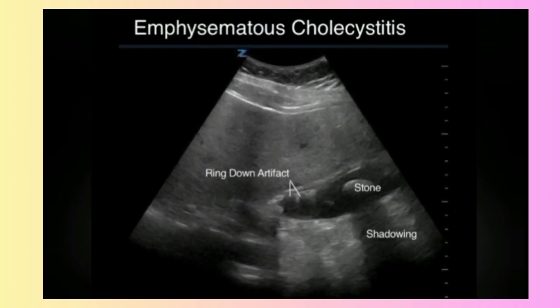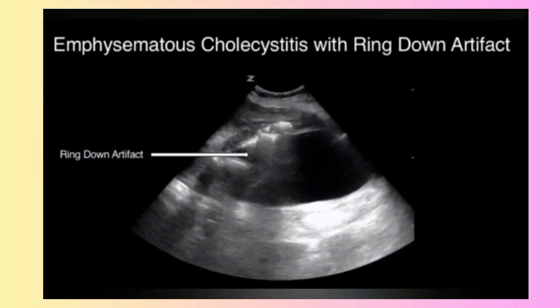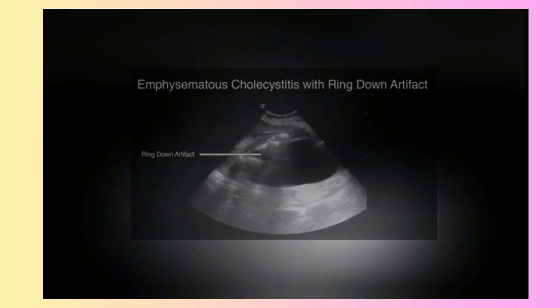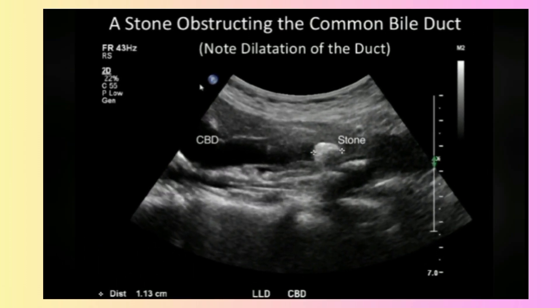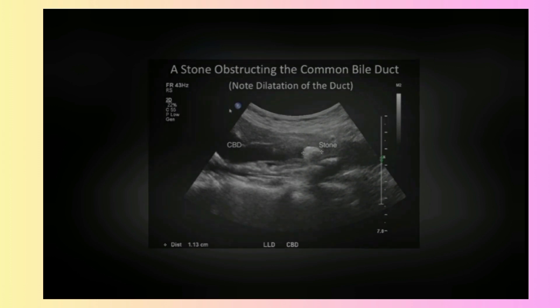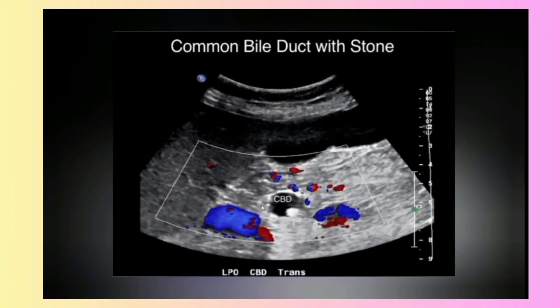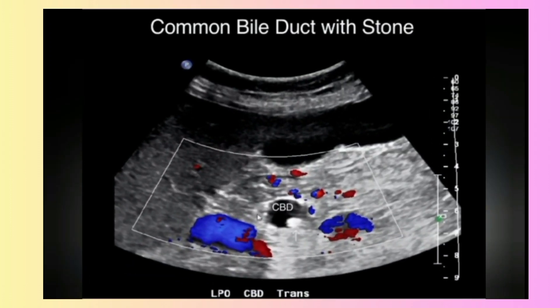Emphysematous cholecystitis. Emphysematous cholecystitis with ring down artifact. A stone obstructing the common bile duct. Common bile duct with stones.